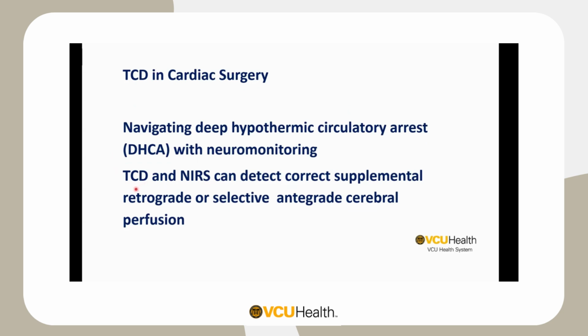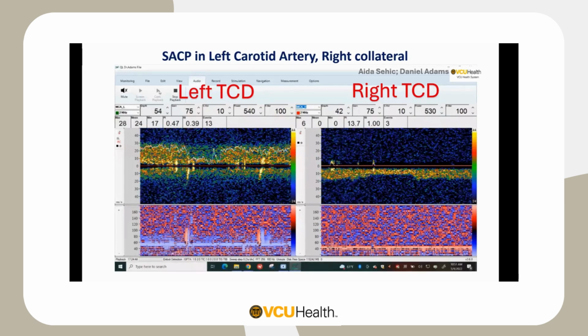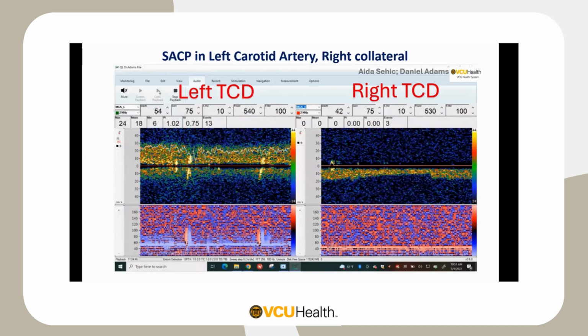It can detect correct supplemental retrograde or selective antegrade cerebral perfusion. So for this, I have an example. This is a short video. This was a selective antegrade cerebral perfusion.